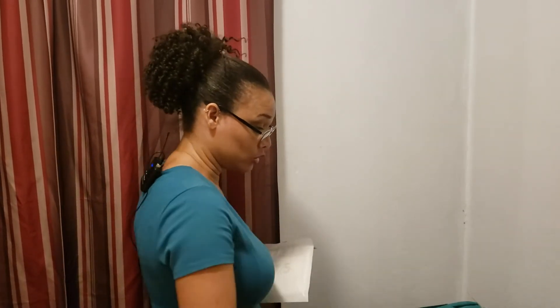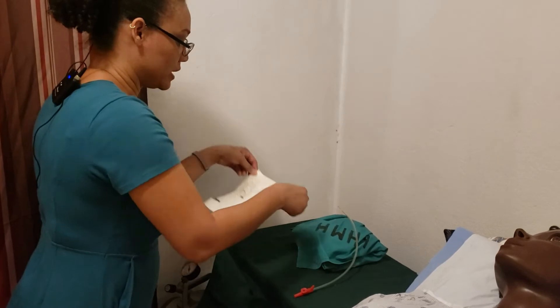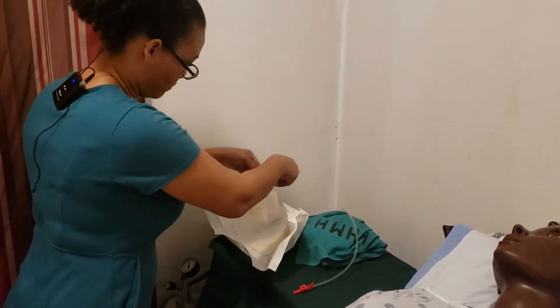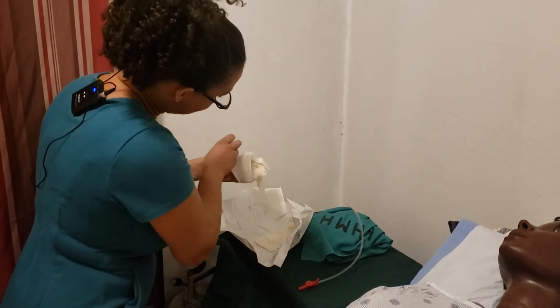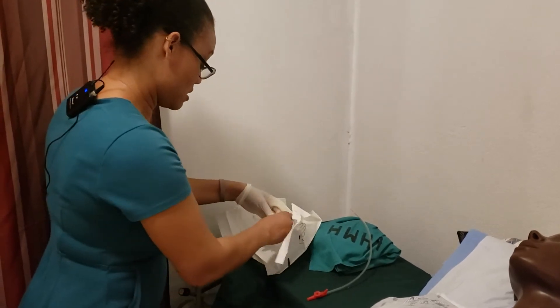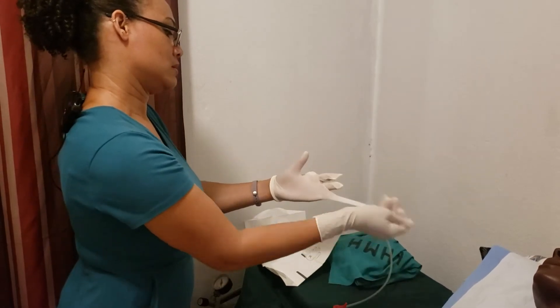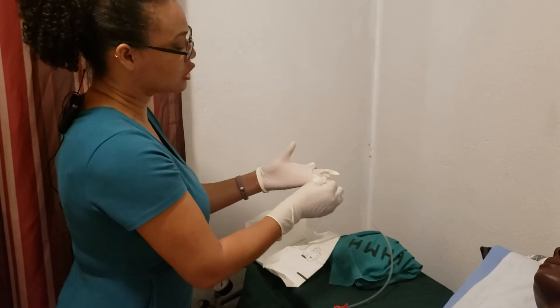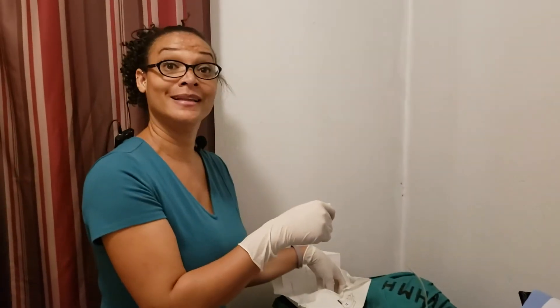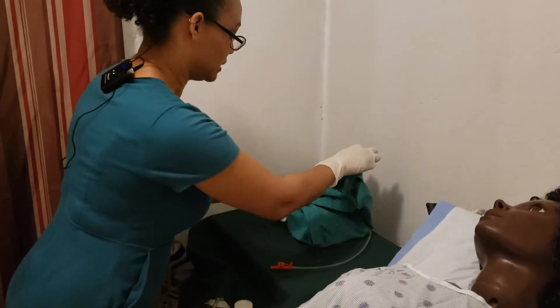For this procedure, we're going to have one sterile hand and one clean hand. You'll notice that I placed the suction tubing with the end on the one-inch barrier that we are considering to be sterile. Now I'm going to prepare to get the sterile tray open. We are continuing to maintain that sterile field.